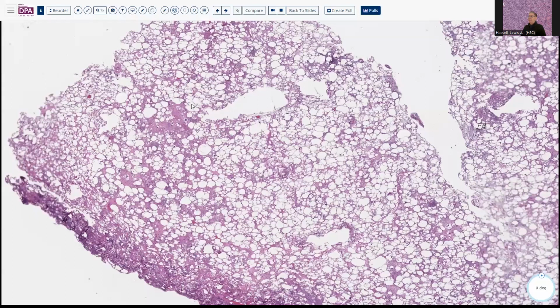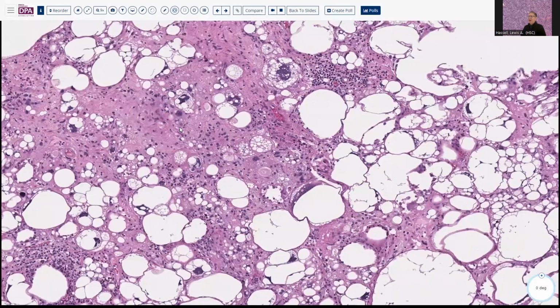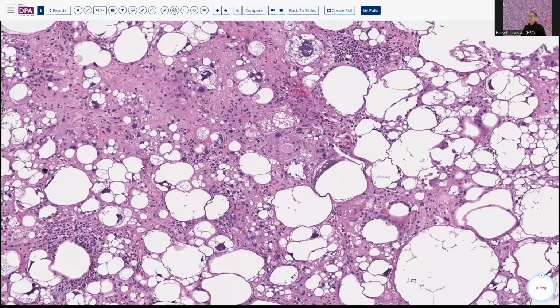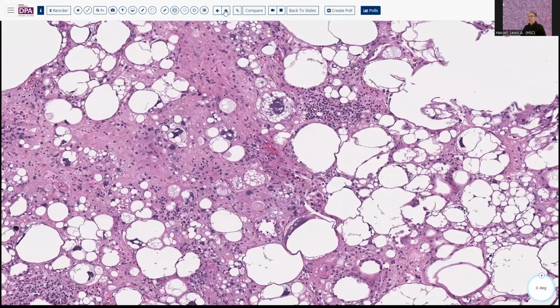But by and large, this is the kind of pleomorphism that's hard to miss. And the fatty differentiation with multiple vacuoles indenting the nucleus, as you see here in numerous cells within this medium power field, should make the diagnosis fairly evident. This is not a tumor that typically masquerades as a variety of other things, so the differential is not terribly long.